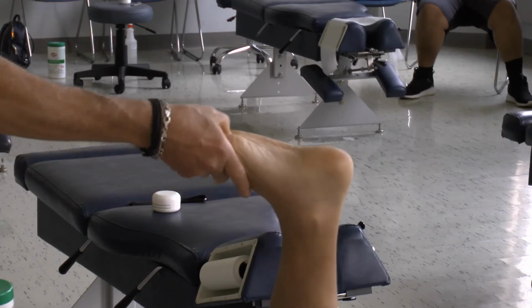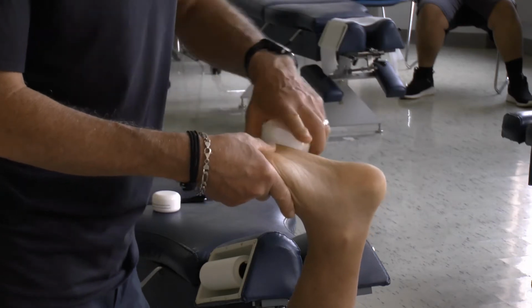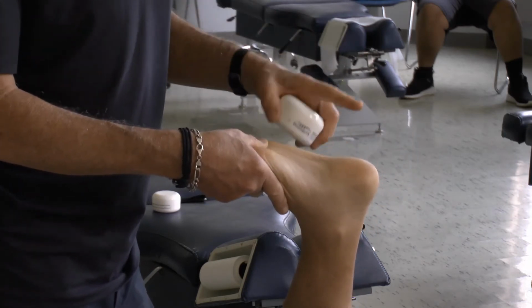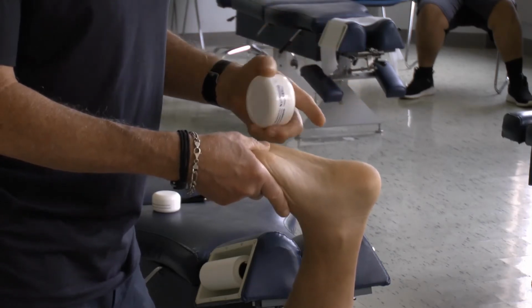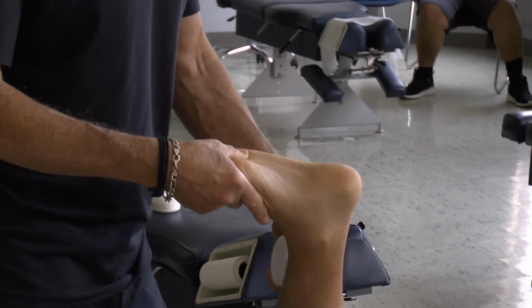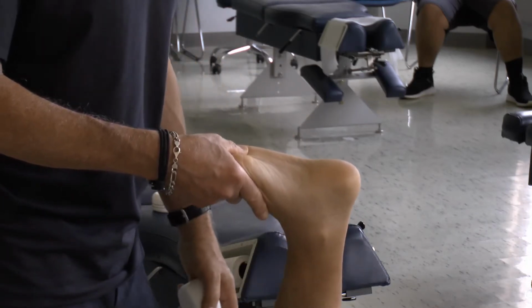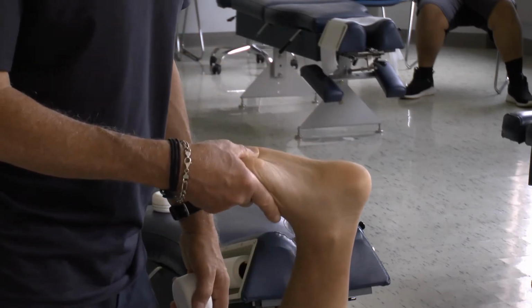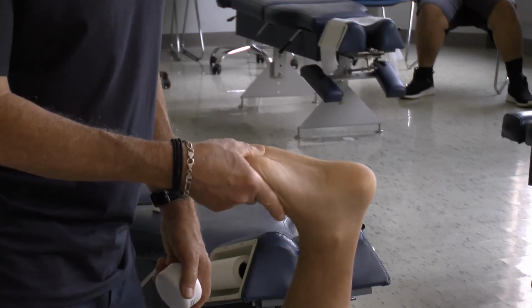Okay, so we are going to treat the plantar surface of the foot. This is a protocol that would be used for a patient who has plantar fasciitis. We're going to also include the gastrocsoleus in this group to improve flexibility in that muscle group and improve ankle dorsiflexion, which is going to be an important aspect of managing a patient who has plantar fasciitis.